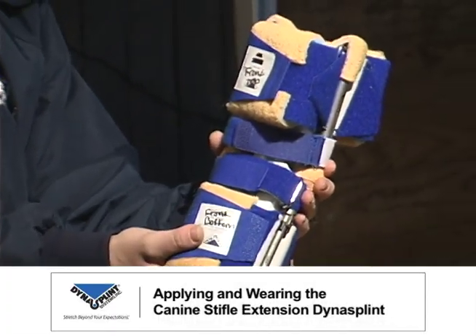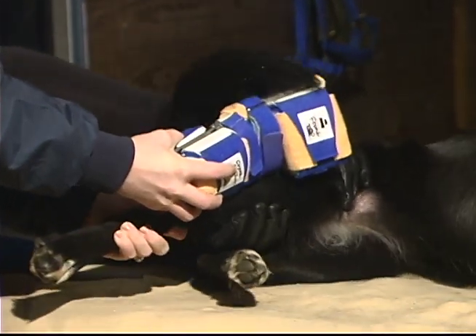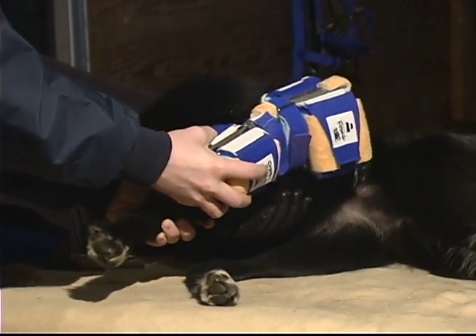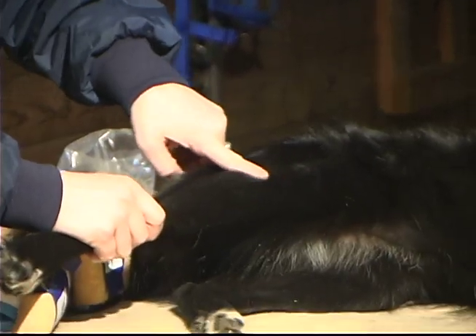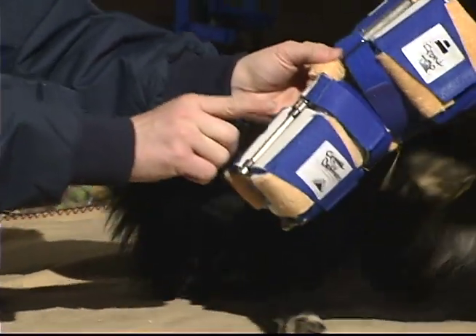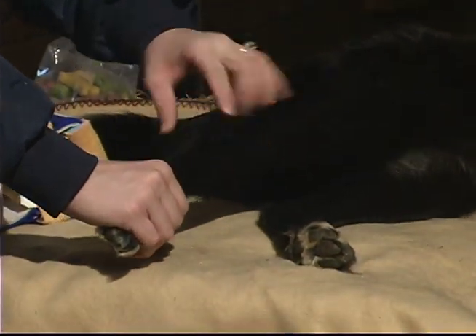To fit and apply the canine extension Dynasplint on the stifle joint, hold the Dynasplint system up against the dog's leg to check the length of the proximal and distal struts. The cam should line up with the middle of the stifle joint. The proximal struts should extend as far up the femur as possible without causing irritation to the groin. The distal struts should extend as far down the tibia as possible without coming in direct contact with the hock joint.